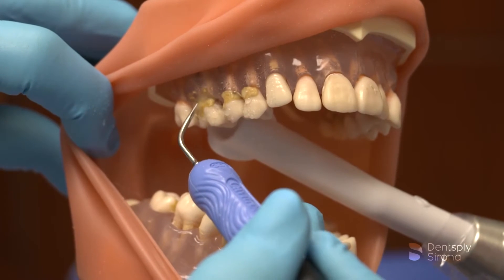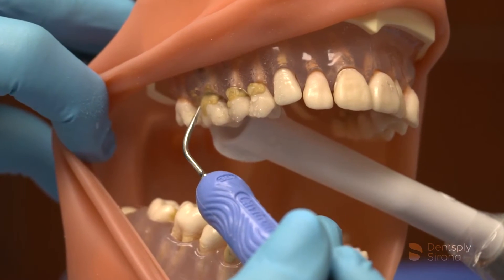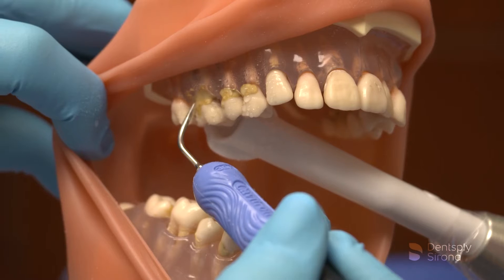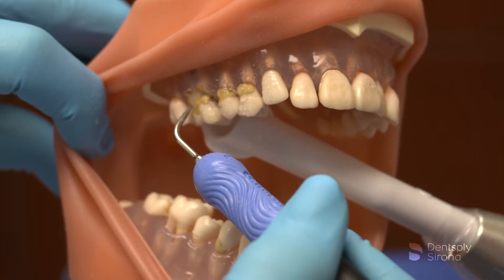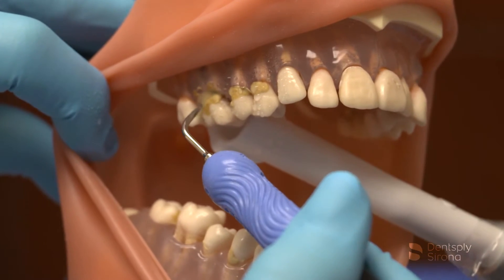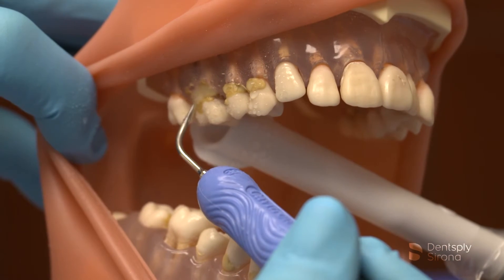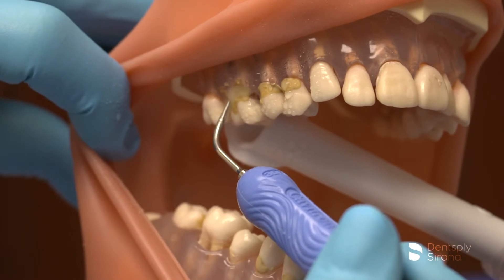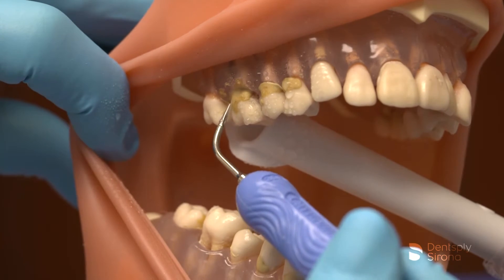The clinician begins by adapting the lateral surface of the Cavitron FSI 10 on the clinical crown and activates the foot pedal to begin the stroke. Adaptation will be in the transverse oblique approach in the healthier sulcus to prevent encountering the junctional epithelium, and in a more vertical approach as indicated.